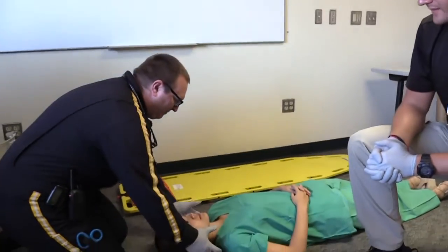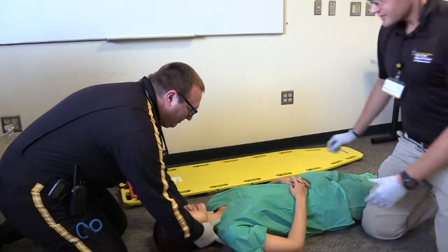When I determine the patient has a possible spine injury, I will direct my partner to take manual stabilization. This means my partner will move the patient's head and neck into a neutral, inline position, preventing extension, flexion, or rotation of the patient's head. My partner will hold manual stabilization until told to release.